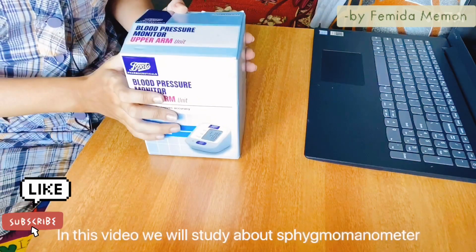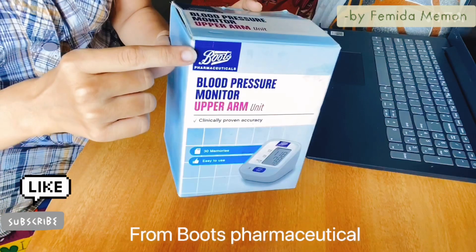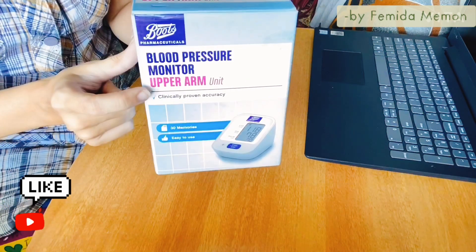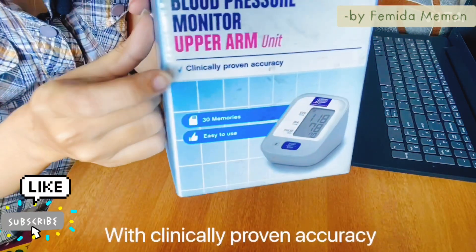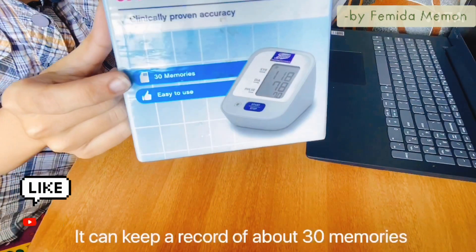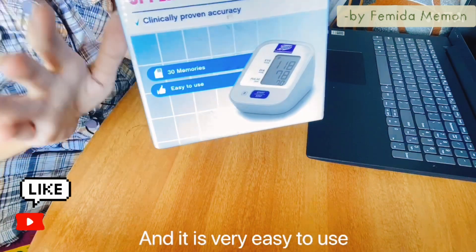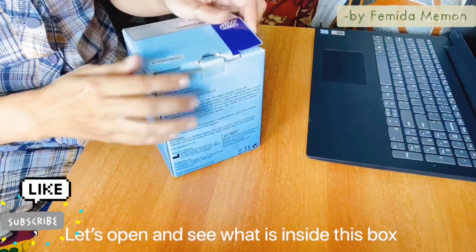Hello friends, I'm Famitha Maiman. In this video we will study about the Sphigma manometer from Boots Pharmaceutical. It is a blood pressure monitor and upper arm unit, available with clinically proven accuracy. It can keep a record of about 30 memories and is very easy to use — anyone can use this. Let's open and see what is inside this box.